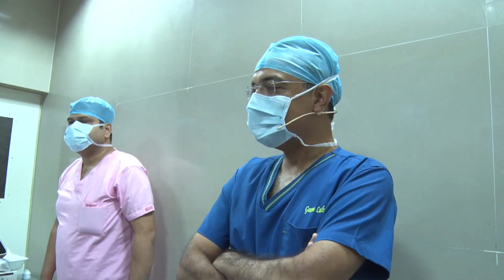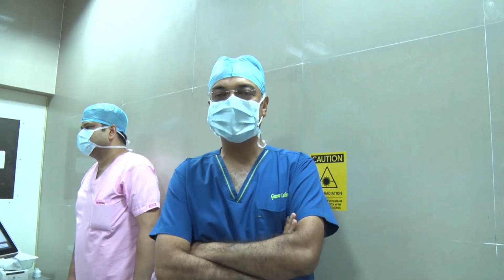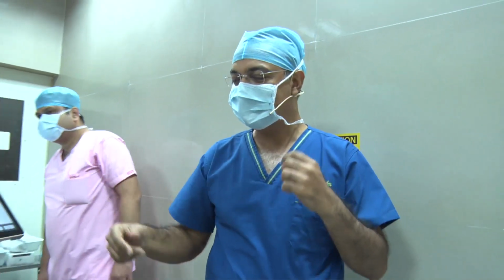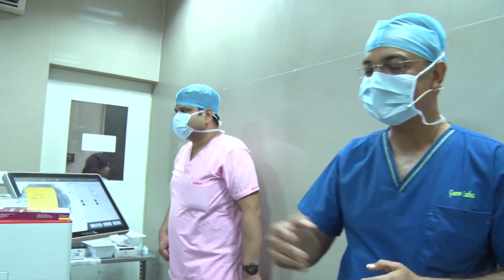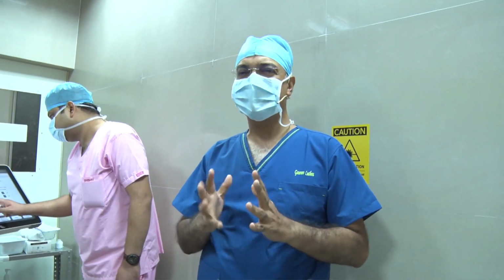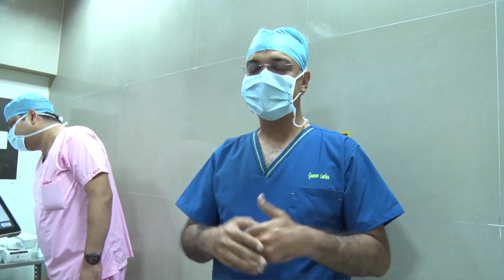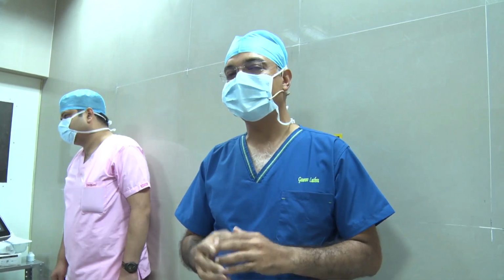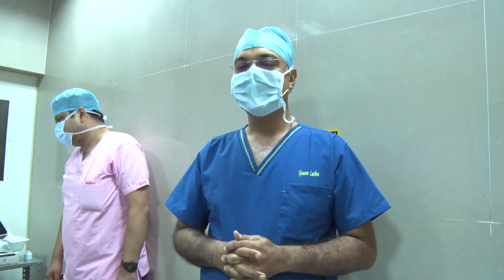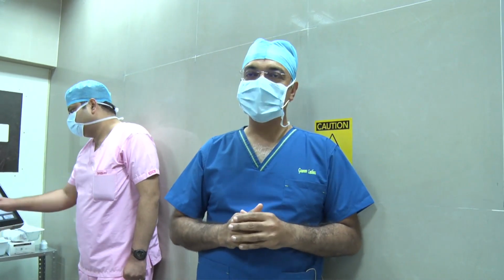So the procedure is very fast, sir, and in some of the complex cases, it makes a lot of sense. But we find that the catalyst is very useful for hard brown cataracts because there the OCT can still scan through it. It's optically transparent. You'll have a reddish hue. So for the hard cataracts, it's very good. We can make a bigger rexis over there, and I like to do the hard cataracts.